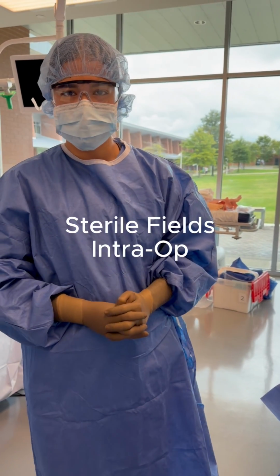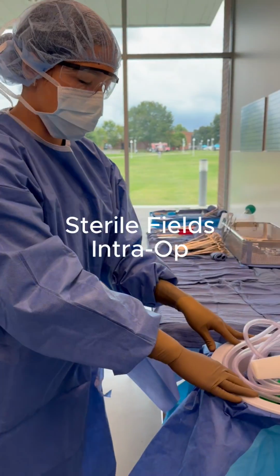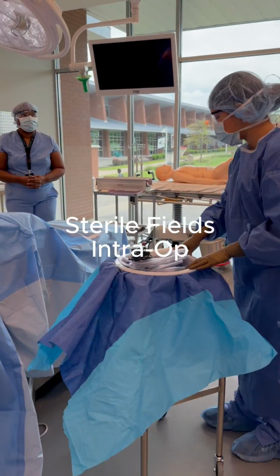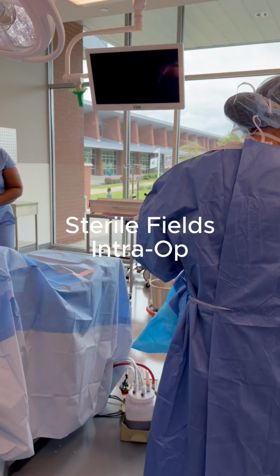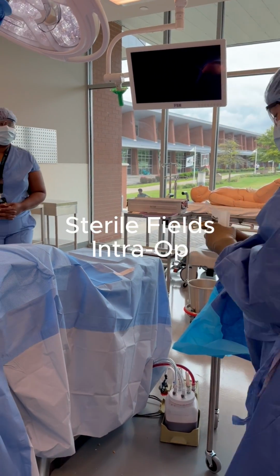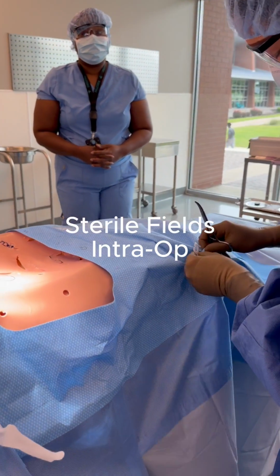Hi, hello, I'm Sandra. I'm going to explain what the scrub does to prepare and move this to the patient. I'm going to grab my basin and move it over here. I'm going to set up the bovie tip first. I'm going to grab some hemostats. I'm going to set up the patient real quick.